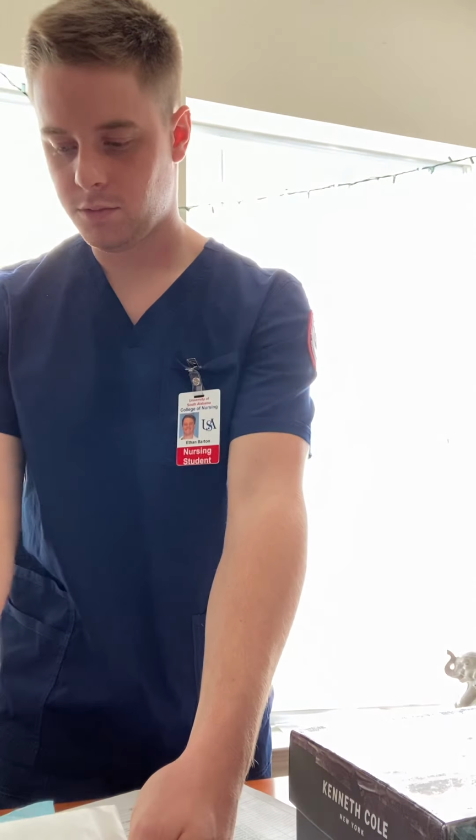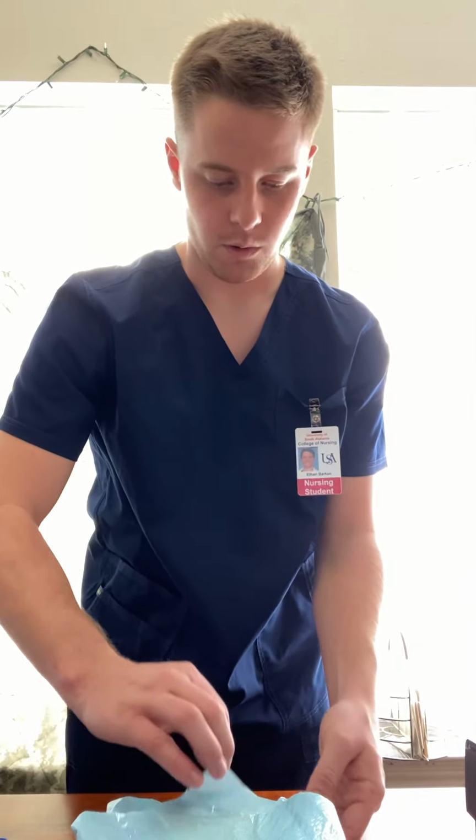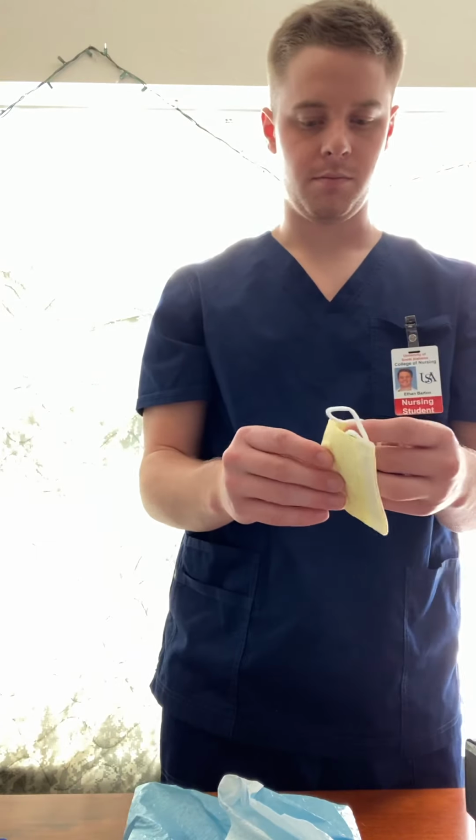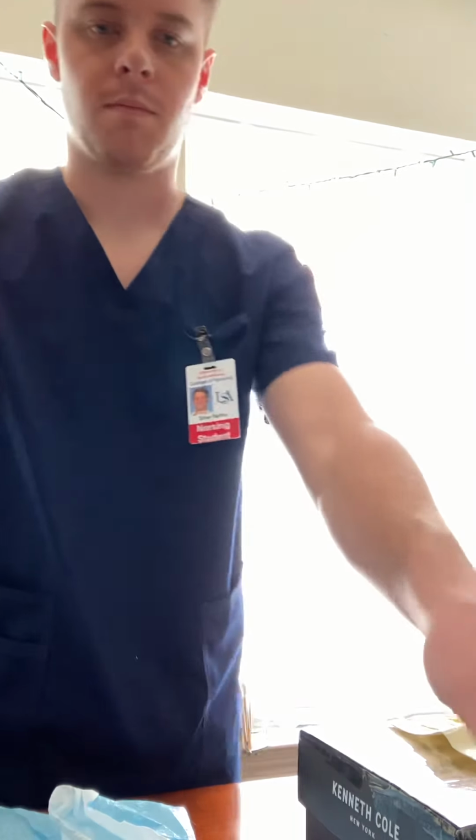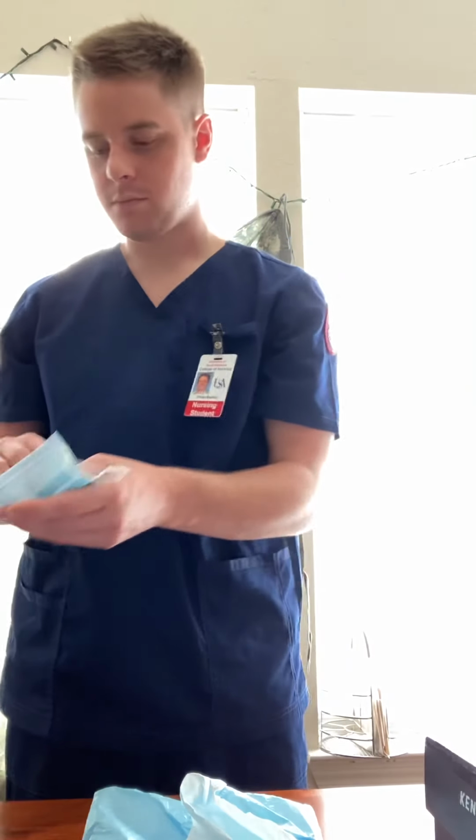After I've done that, I'm going to remove my kit. I'm going to move the camera so you can see. Open it away from me. Then I'm going to get the patient's mask. Place it on the patient. Move the camera so you can see. Now I'm going to don my mask and goggles.